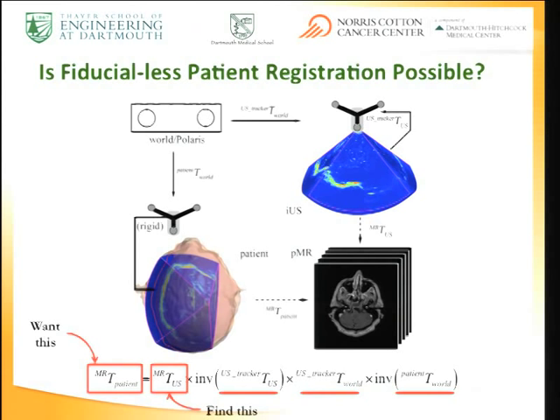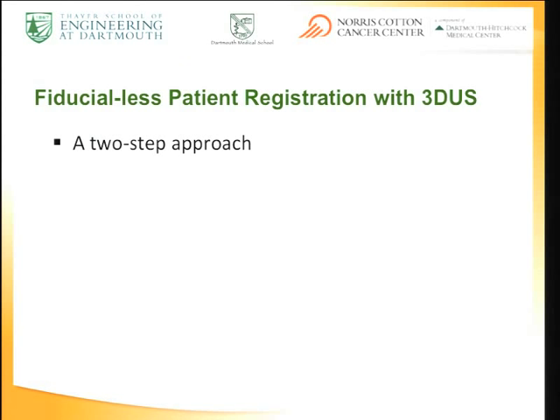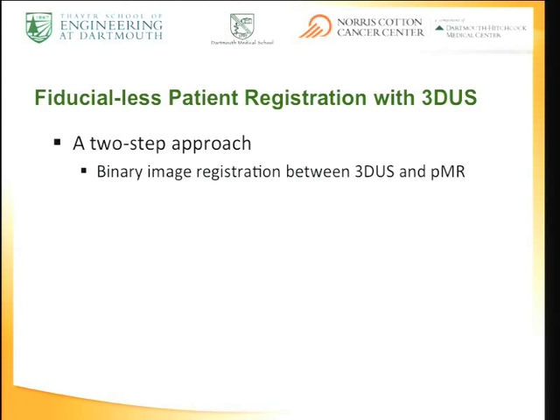So we developed a two-step approach, following some other work in the literature, where we made a binary registration. One of the challenges is how do you get it started? David didn't want to use the fiducial registration to get started. He just wanted to say, here, I don't know where it is. I'm not even telling you what part of the brain I'm going to be operating on. What would be the minimum information that we would have to provide? So this binary registration helped us get there, and I'll show you how we did that.